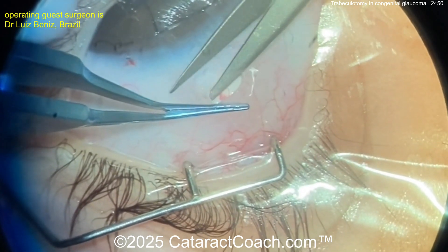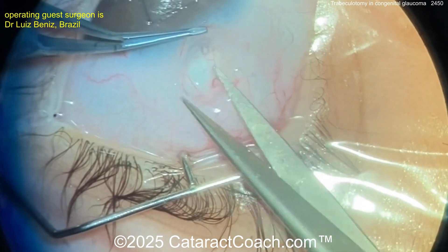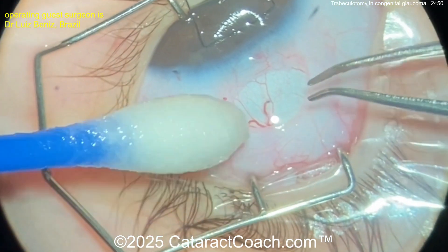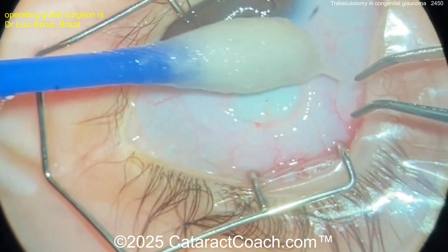Back to our case — very careful dissection. You can see this is obviously a very, very young patient with congenital glaucoma. Remember, this surgery is going to help a lot, but it's just the beginning of the journey. This patient needs to be closely monitored and followed for many, many years to come.